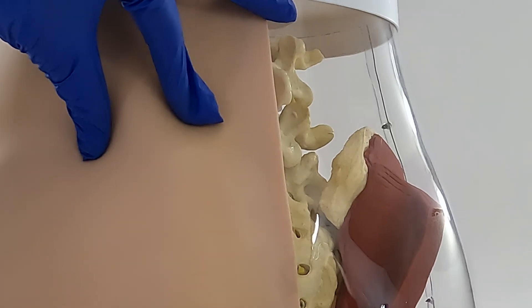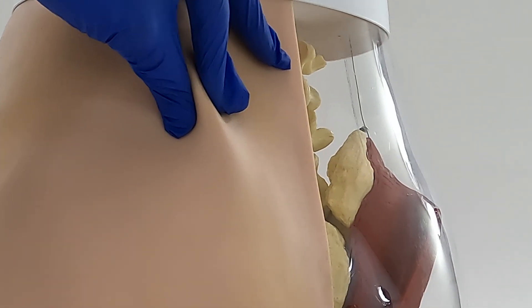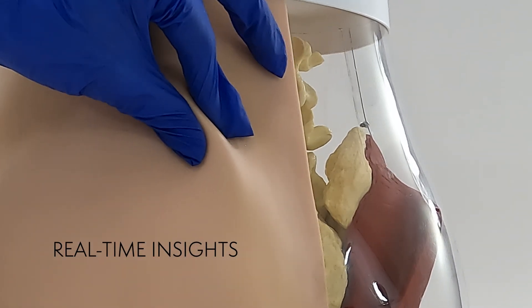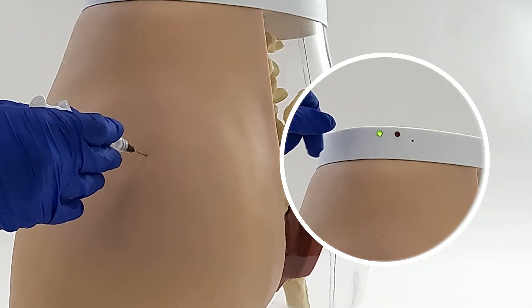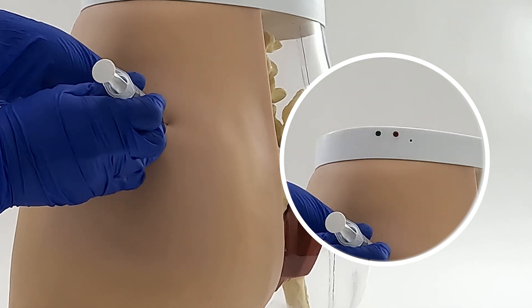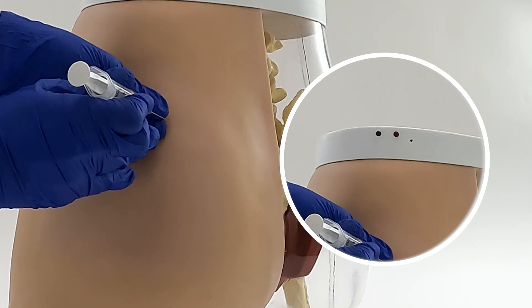The model is half covered in a realistic simulated skin over a series of sensors that provide real-time insight into the accuracy and safety of the injection. Green LEDs light up when correct injection sites are acquired, while red LEDs accompanied by a buzzer signal incorrect sites, providing instant interactive feedback.